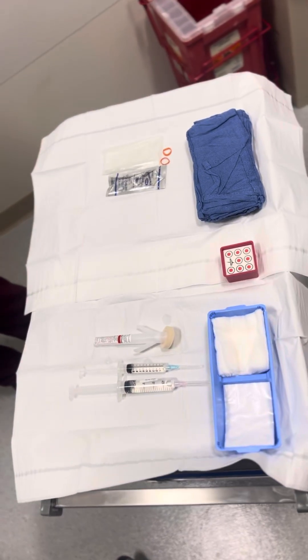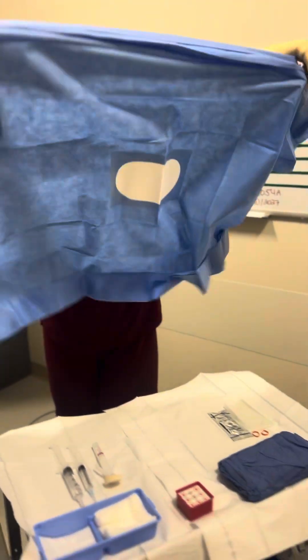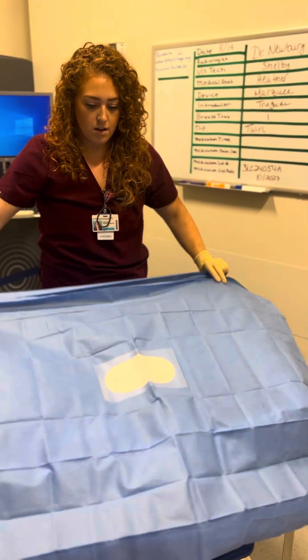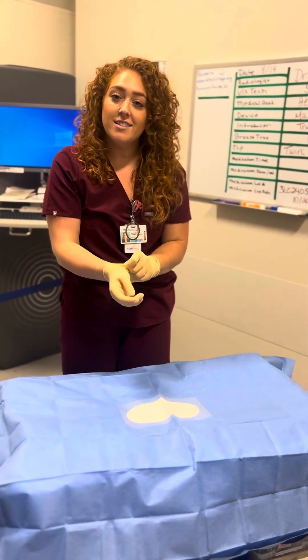Now I'm going to take this sterile drape and protect our sterile field. And that is it — thank you.